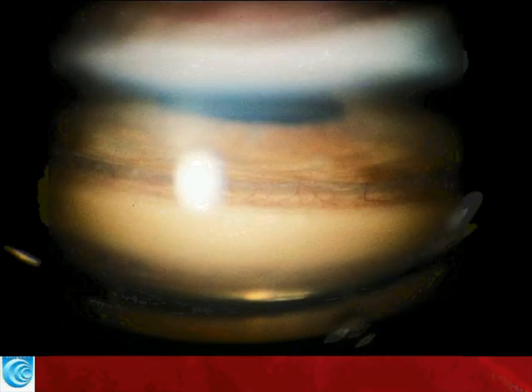In this photograph, we see a patient with neovascularization due to a central vein occlusion, and in this case, the blood vessels branch significantly. They are irregular. They move and look like tree branches. They are very fine, and they cross the scleral spur, trabecular meshwork, and even cross Schwalbe's line.